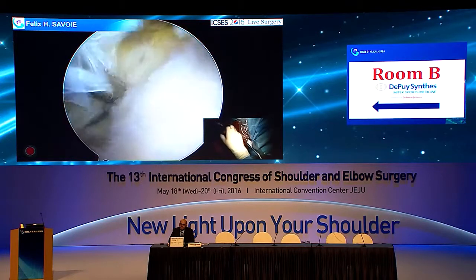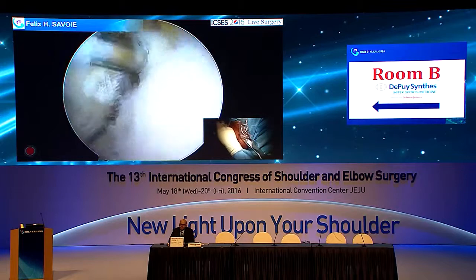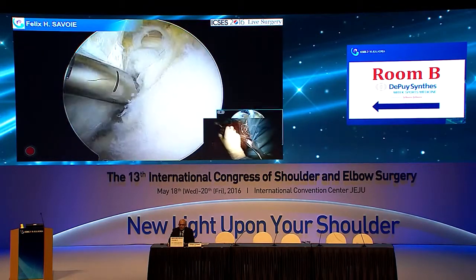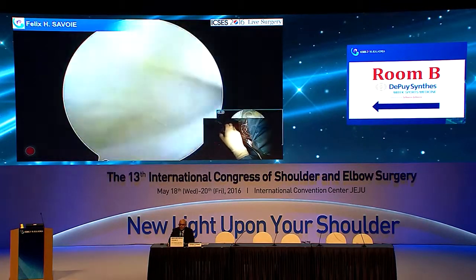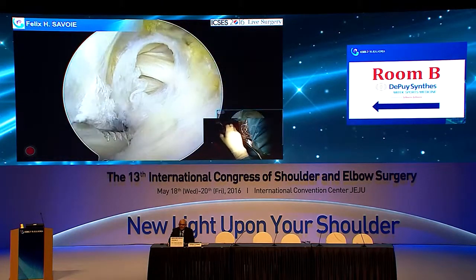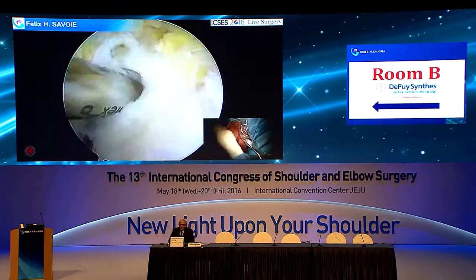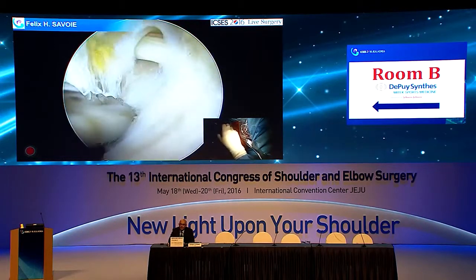That's this big structure here on the base of the coracoid. And so you can see here, it's very thick. And one of the things that it helps is we know that, oh, look. You know what that is? You see this right here? Oh, yeah. This is a congenital variant. That is an accessory pec minor tendon. See that on top? Yeah, I'll clean it off so you can see better. How exciting.